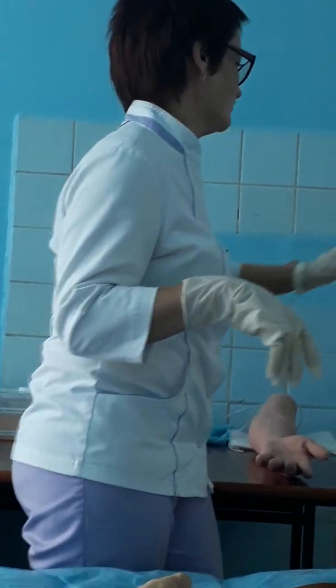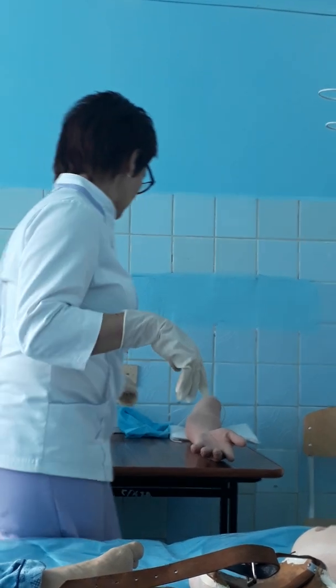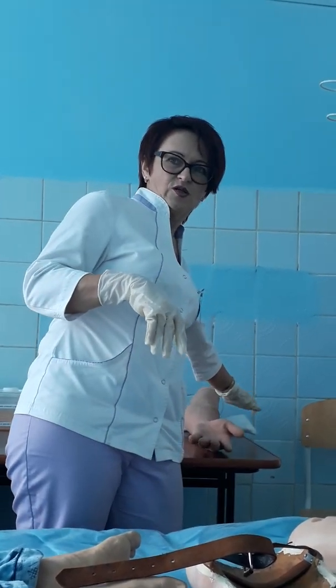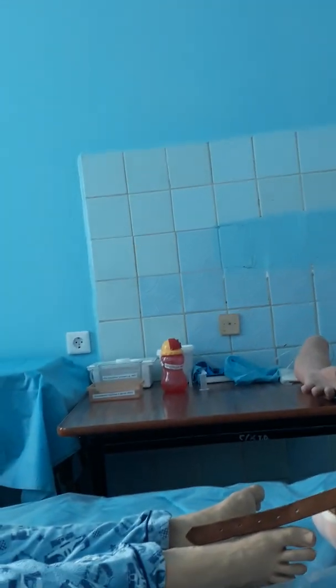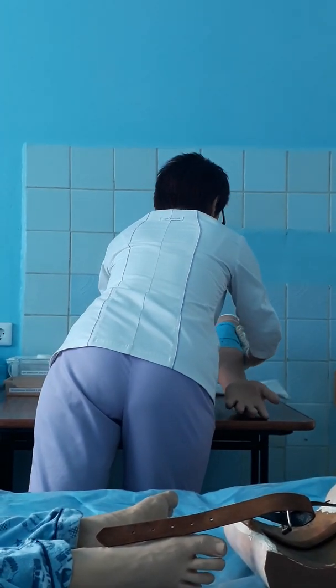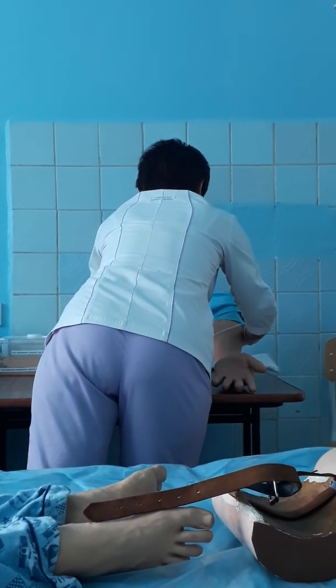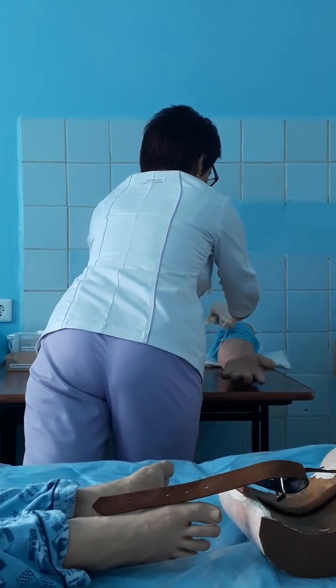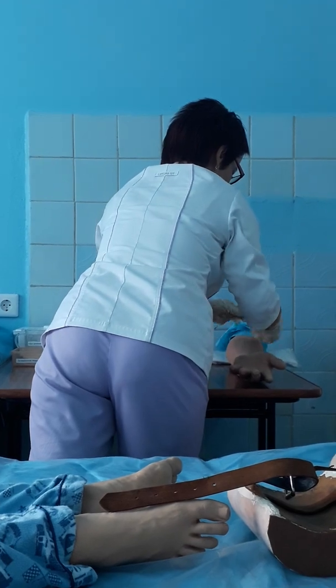More often with needles you lay a special pad on the hand under your patient. Close the bare skin with a clean napkin. With clothes you can do it without a napkin.